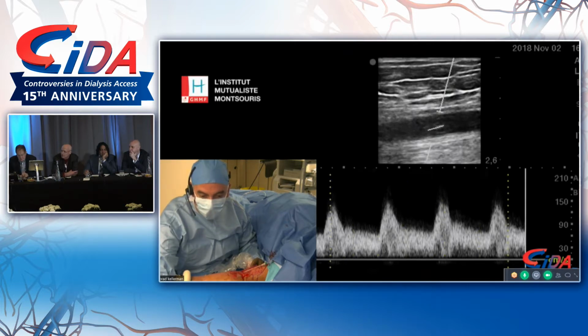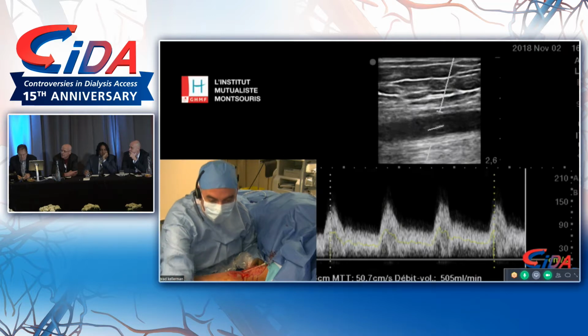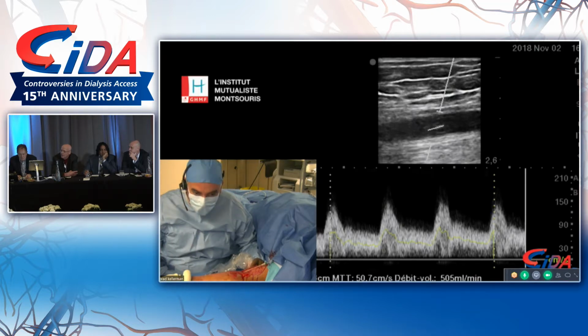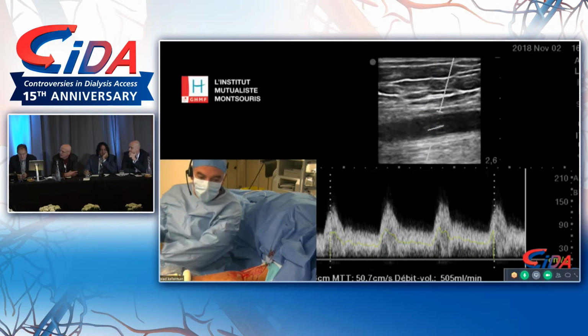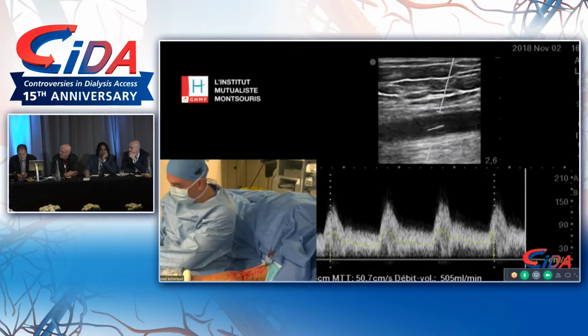And we do it in the OBL. A patient will come in at 8 o'clock, and I do blocks myself. We use lidocaine, and the lidocaine wears off in about an hour. So the patients will come in at 8. They'll leave by 9:30. Nice.